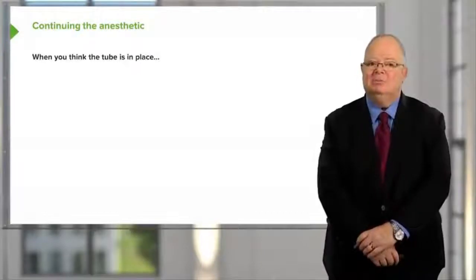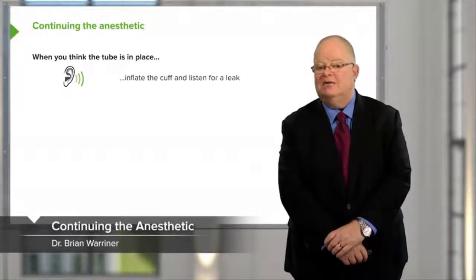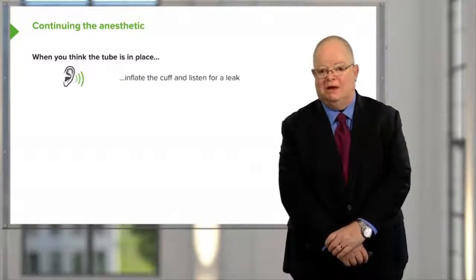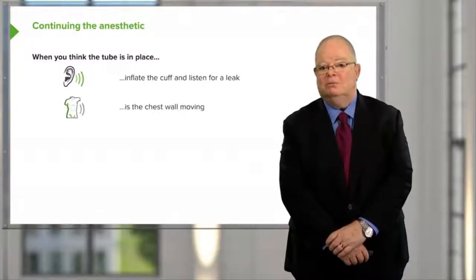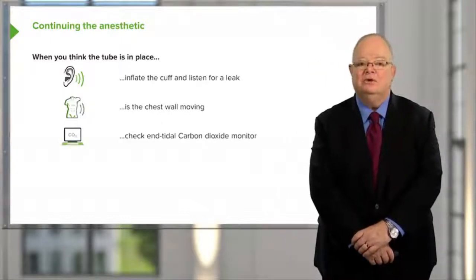Once you think the tube is in place, inflate the cuff and listen for a leak around the cuff. The inflation should be just enough to stop the leak. Look at the chest wall. Is it moving? Look at your end-tidal CO2 monitor. Are you getting CO2 back?